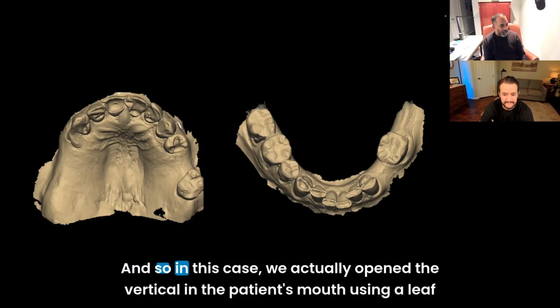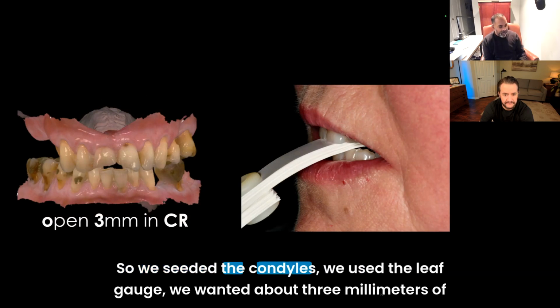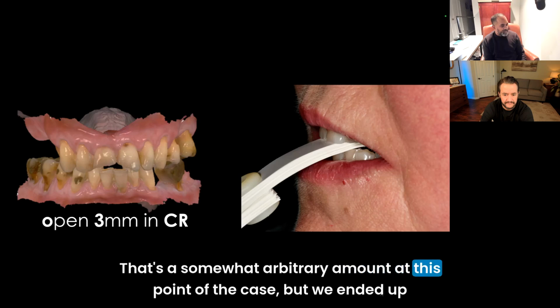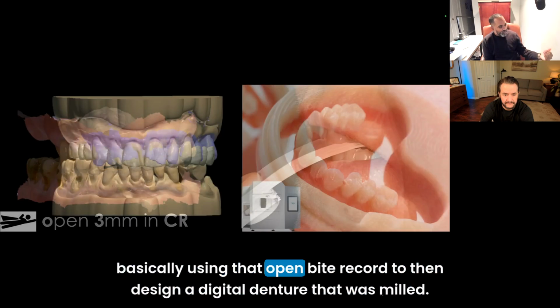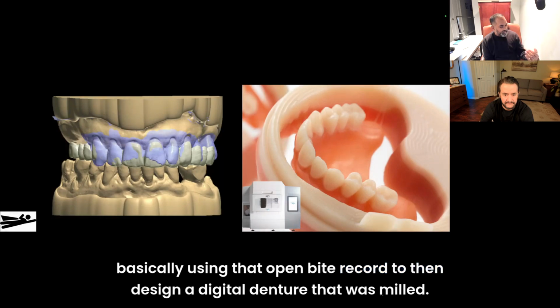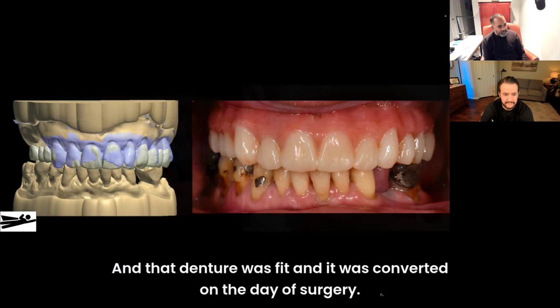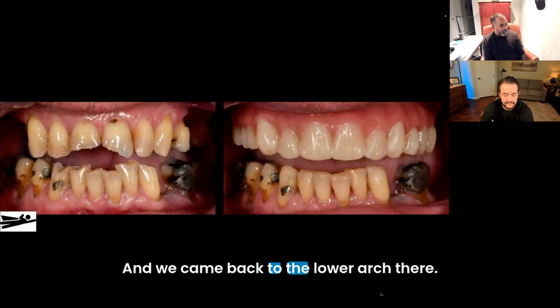Yeah. And so in this case, we actually opened the vertical in the patient's mouth using a leaf gauge. So we seated the condyles, we used a leaf gauge. We wanted about 3 millimeters of opening. That's a somewhat arbitrary amount at this point of the case, but we ended up basically using that open bite record to then design a digital denture that was milled, and that denture was fit, and it was converted on the day of surgery, and we came back to the lower arch there.